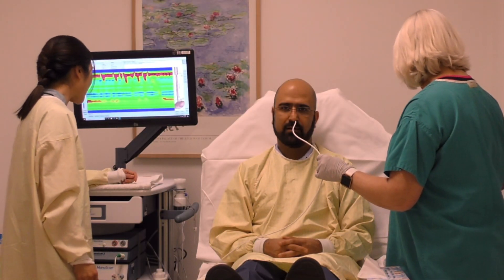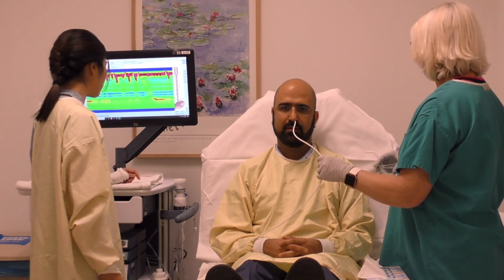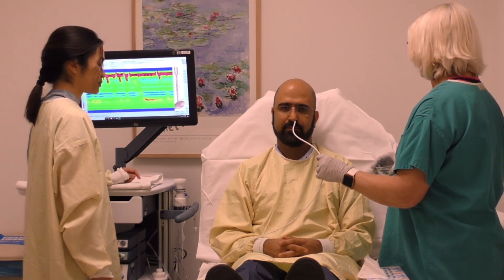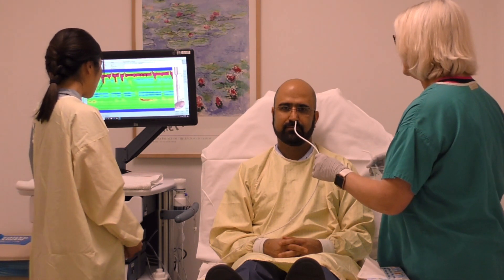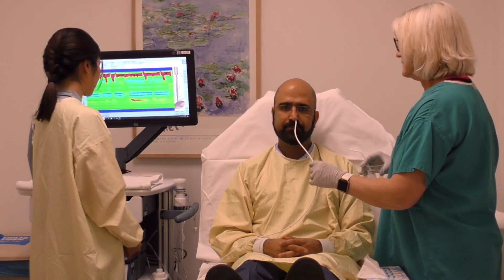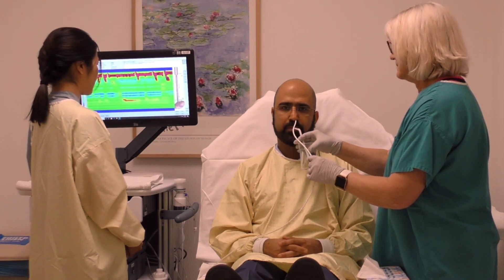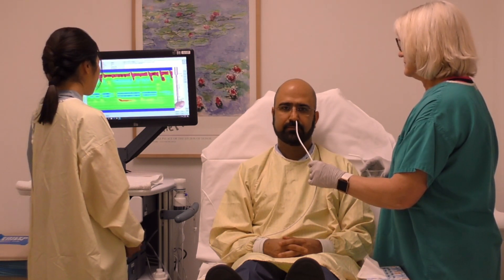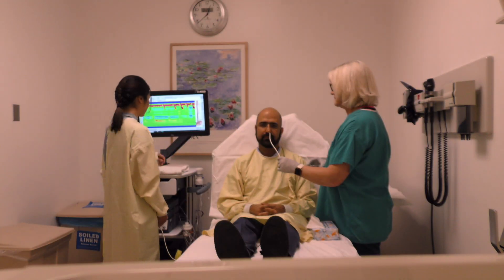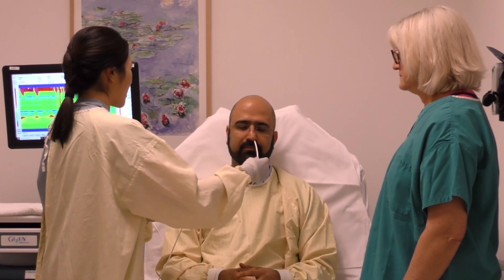We are done with the first part. You can relax and swallow if you need to. Next, you will sip and swallow water. Each time, Vicki will give you a cup of water with a straw. You will sip and swallow about 10 times and I will count each time. Vicki, go ahead with sip-swallow one. Take a small sip and swallow. Sip-swallow two... sip-swallow three... sip-swallow ten. You're all done. I'm going to take the catheter out now — please hold still.